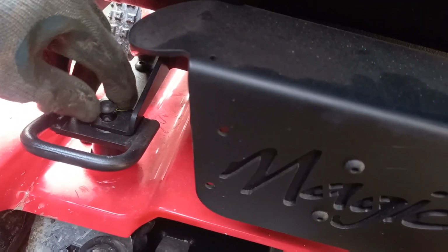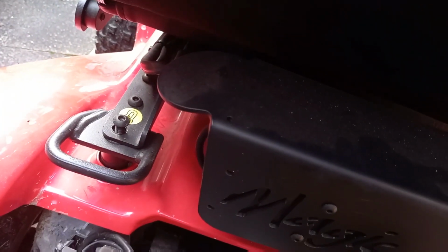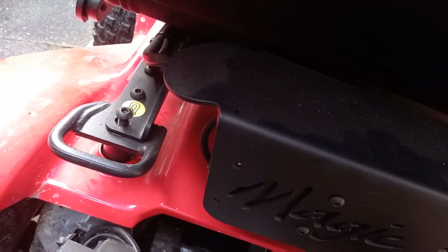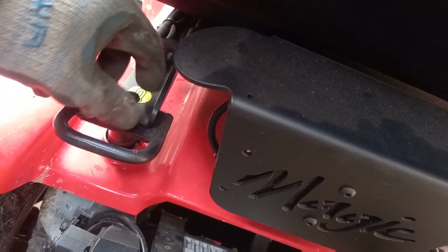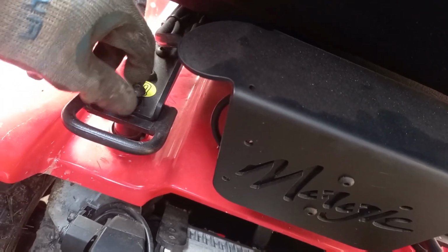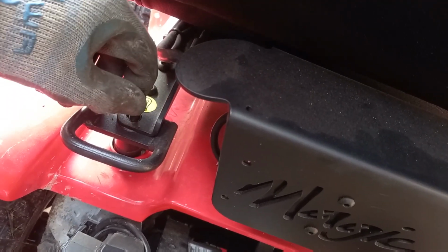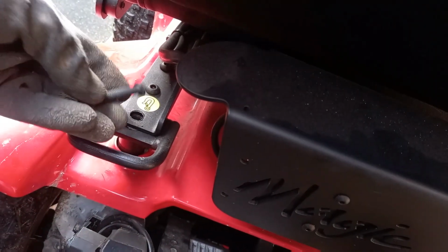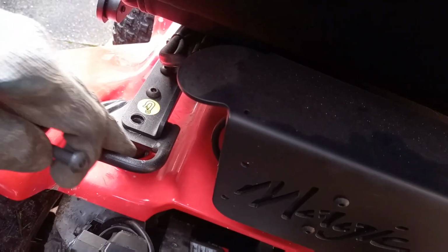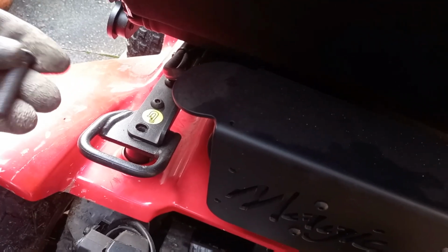Now the strange thing is, none of the fasteners on this chair seem to have washers, no plain washers and no spring washers, which strikes me as being a bit crazy, really, because with vibration and going off-road and whatever, there's no thread locking compound on it, otherwise I wouldn't be able to undo that like that. You see? But there's no spring washer to stop it from coming undone, which is a bit odd, but it's not like an off-road blooming quad, is it?